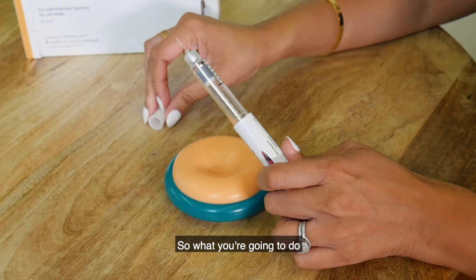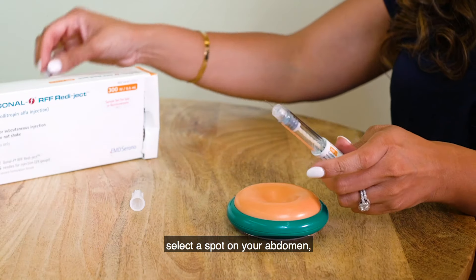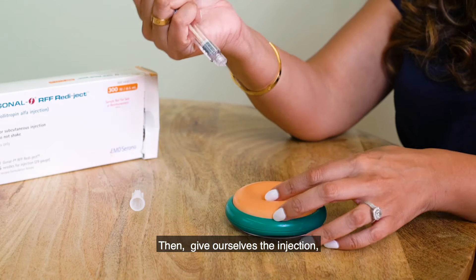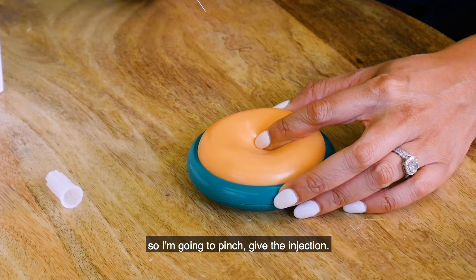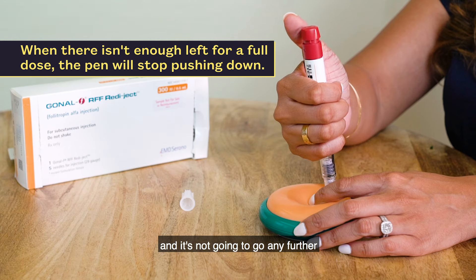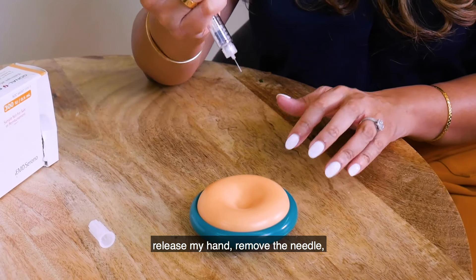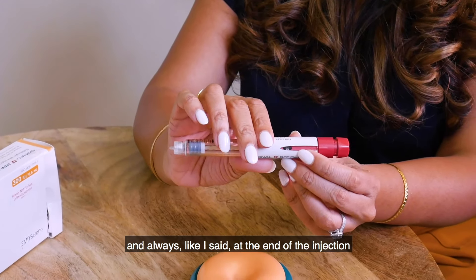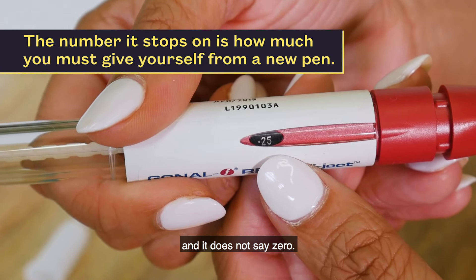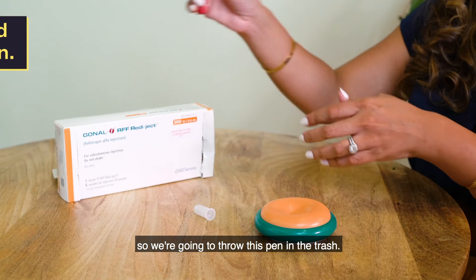So what you're going to do is go ahead and dial your dose, select a spot on your abdomen, and clean off with alcohol. Give yourself the injection — pinch, give the injection, and as you're going down eventually it's going to stop and it's not going to go any further no matter how much you push. Release your hand, remove the needle, and always at the end of the injection make sure you look at the dial. You'll notice that the dial has a number in it and it does not say zero — so if this happens, remove the needle. This pen is finished, so we're going to throw this pen in the trash.